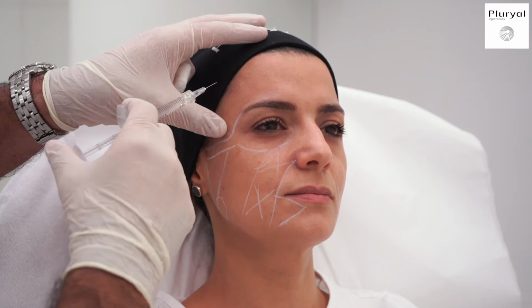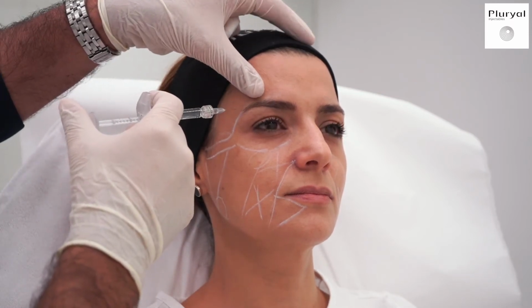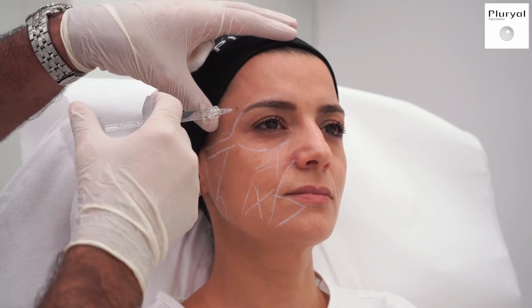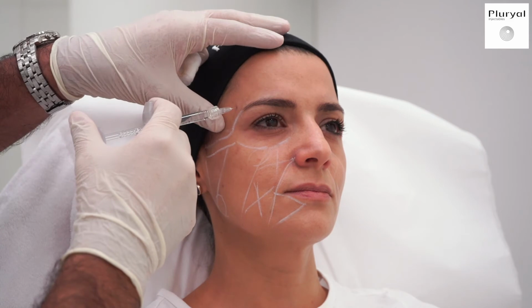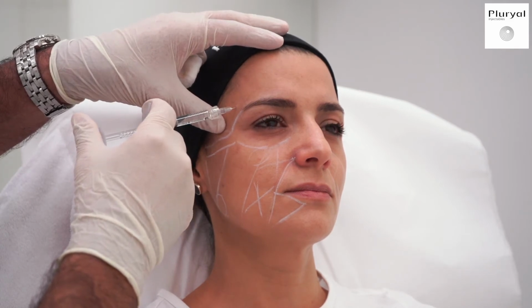You will now feel a small pinch. 1, 2. So you go all the way to the bone. You aspirate. And then you start injecting slowly.